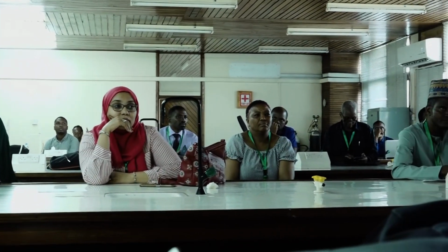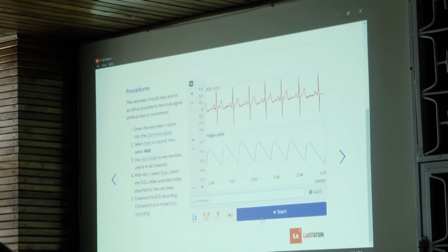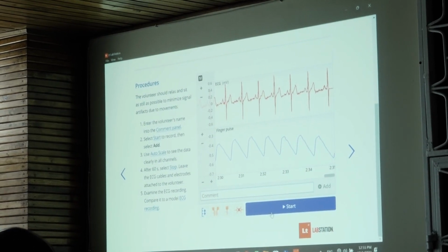Anything? Maybe one more thing. The device, of course, is human safe, which means it's electrically isolated. So even if there's a thunderstorm now, where lightning hits the building, he's safe. Probably not if the building collapses, but at least from the device.